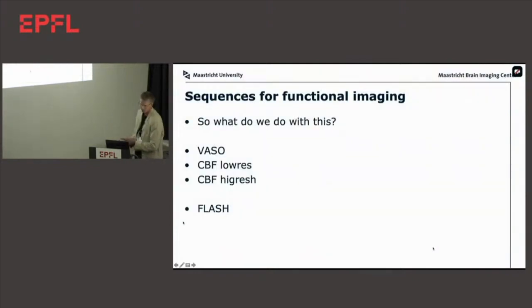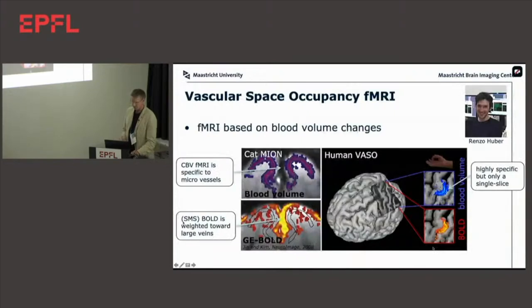So what can we do with that wonderful thing, EPI? I'm just going to show you some examples of where we have been pushing things. We, not always being me, obviously, it's the other people that do all the hard work. One of them being Renzo, who has been pushing the 3D EPI with a VASO preparation very hard, VASO being an fMRI method that measures changes in blood volume instead of BOLD. And the nice thing is that the blood volume changes, they're pretty well localized to the capillaries.